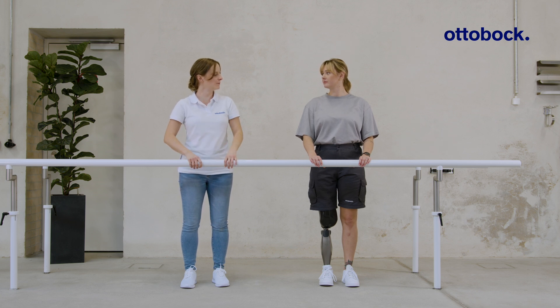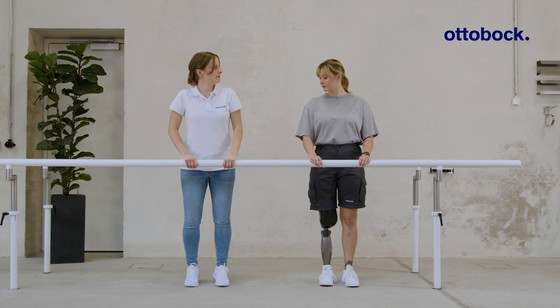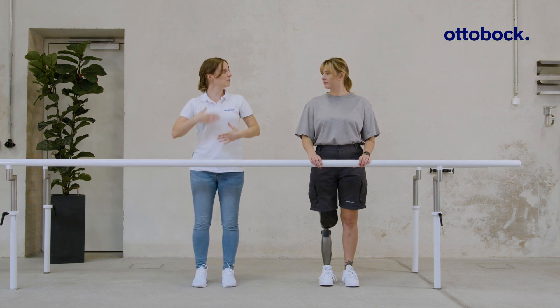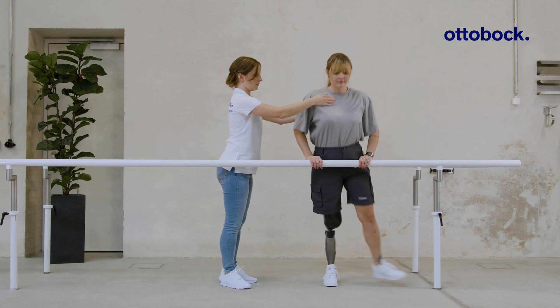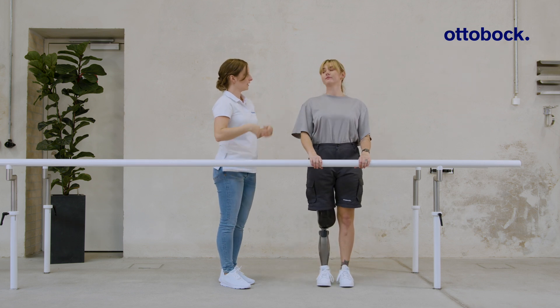This exercise is used to practice shifting weight onto the prosthesis and to increase trust in putting sufficient weight on it. Pay attention to the rhythm and the even alternation of the load between the legs. Be aware that a good socket fit is a prerequisite for using this function.